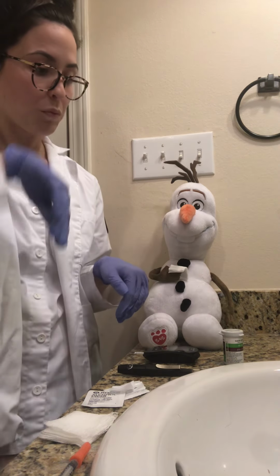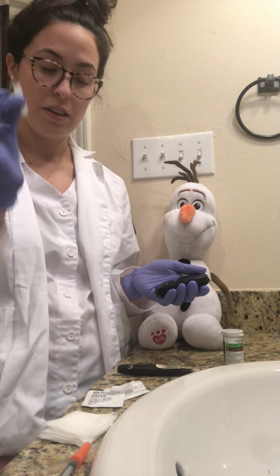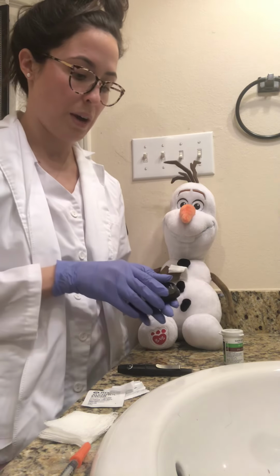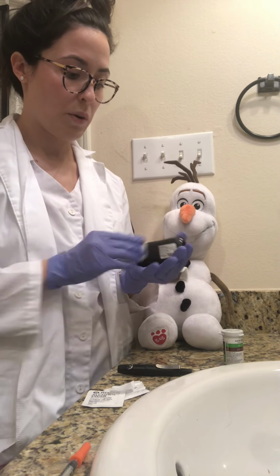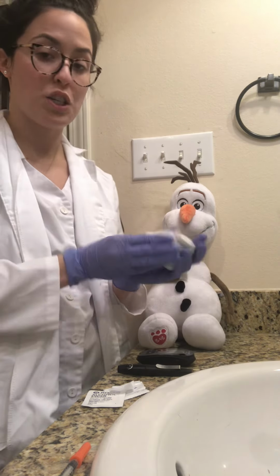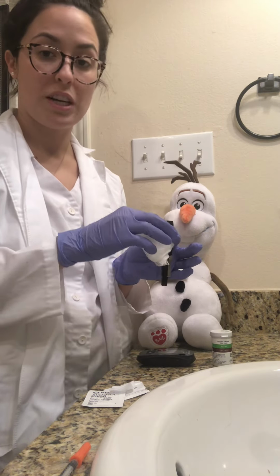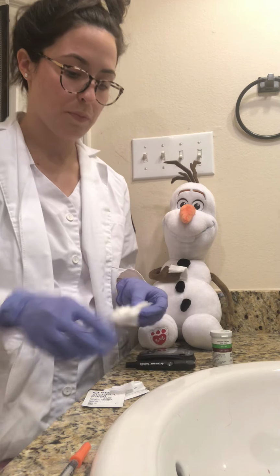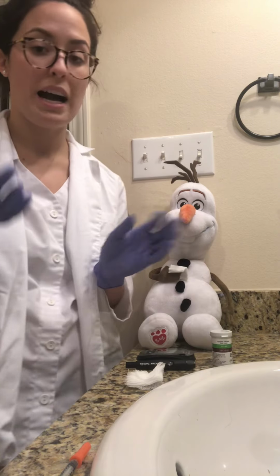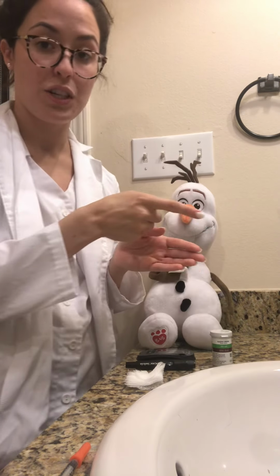So at this point, what I would do prior to doffing my gloves is get rid of the strip, properly dispose of that in the trash. I would disinfect the monitor with a cleaning wipe, as well as the strips if you're bringing them back onto the unit, as well as the sticking mechanism. And you just want to be sure to get the lancet out of here and dispose of it in the sharps as well on your way out. And then just dispose of your alcohol swab in the trash, doff your gloves, and then perform hand hygiene. And then we'll head out the room. I'm going to perform my hand hygiene.